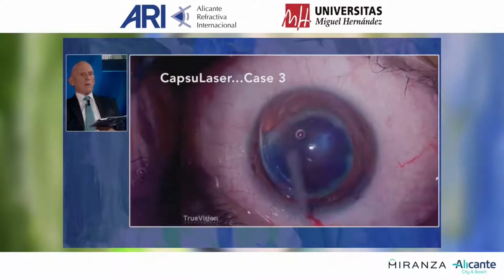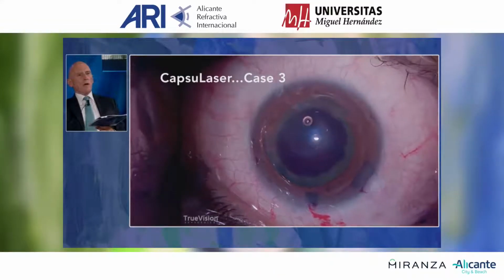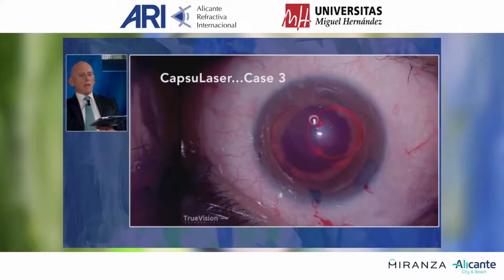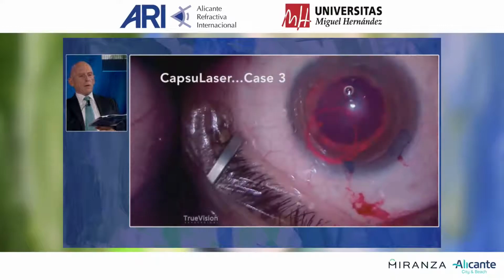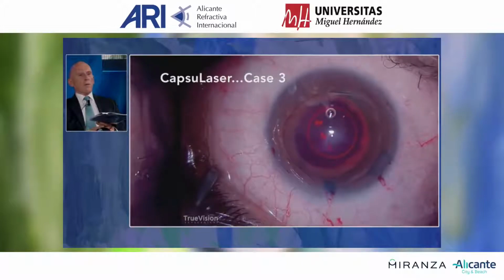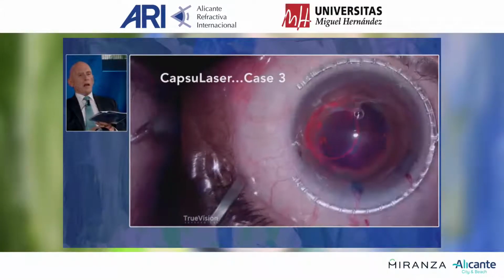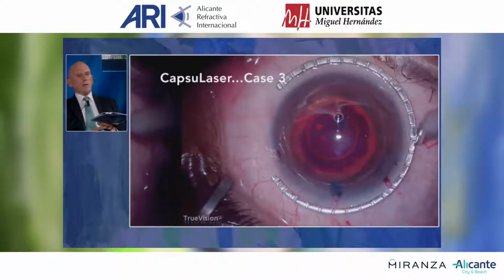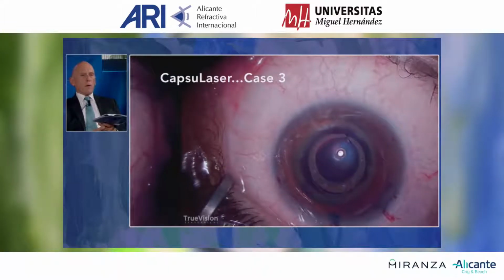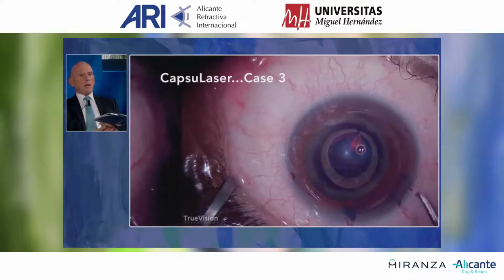You see that because the pupil was small, we are staining just the center, but even in this case we have a clear image of the most stained part of the crystalline lens capsule. Because of this trypan blue, the intensity is really clear, and we can center on this very center that is highlighted by the high staining, and use the second Purkinje image as the centration reference for our practice. Here we had this 5 mm capsulorhexis, again, perfect.